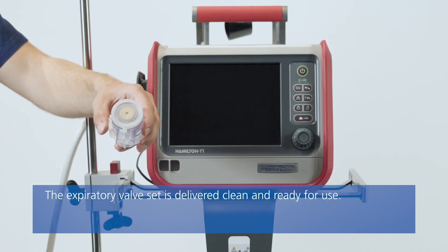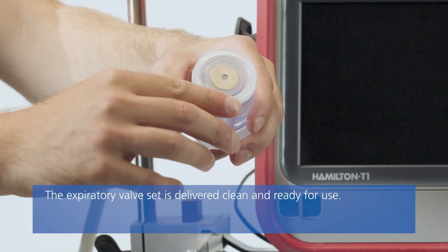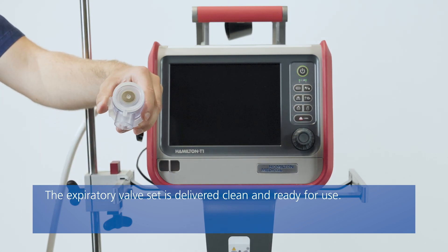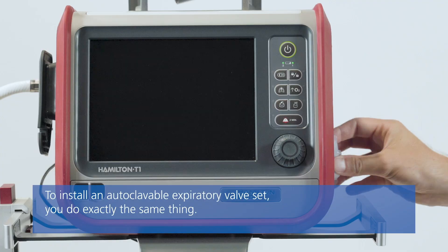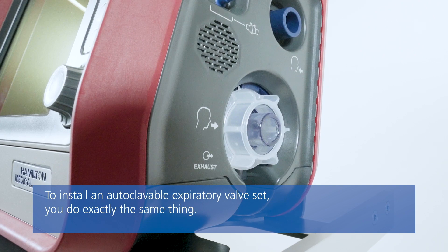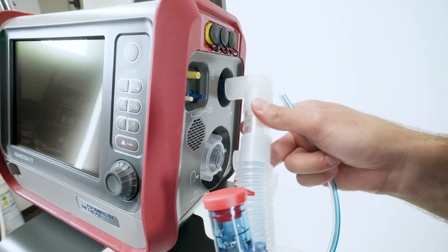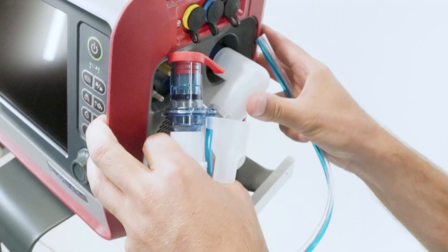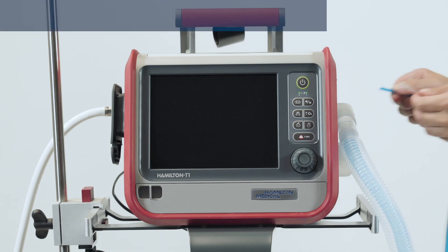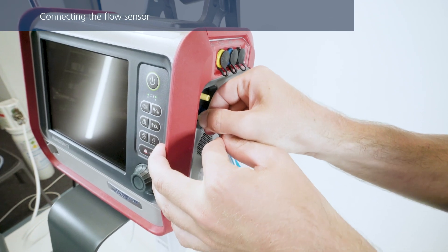First, remove the safety cover and check that the membrane is properly aligned with the expiratory valve housing, and the metal plate is facing upwards. Position the expiratory valve set in the expiratory port and twist it clockwise until it locks into place. To connect the coaxial breathing circuit, first attach the main tube to the inspiratory port, then connect the elbow adapter to the expiratory valve. Lastly, attach the blue and clear tubes to the flow sensor connection ports.